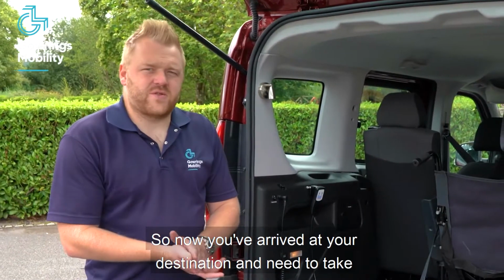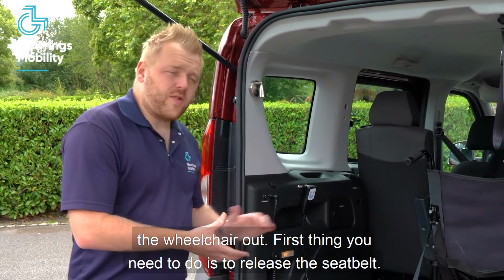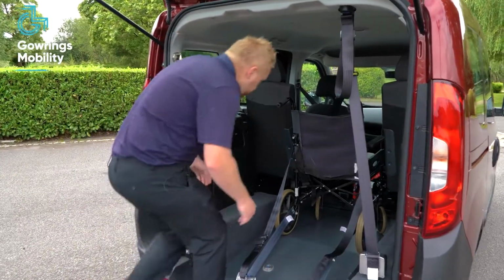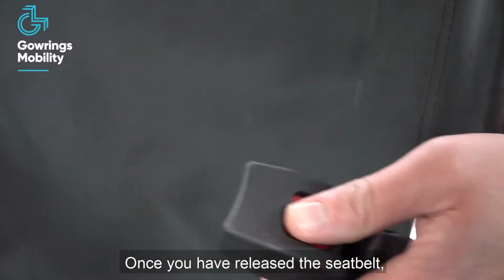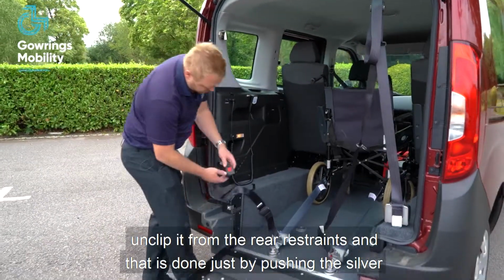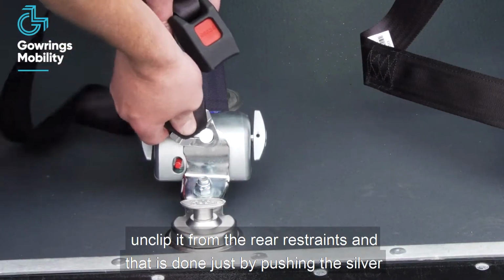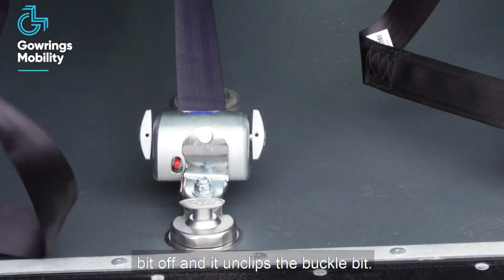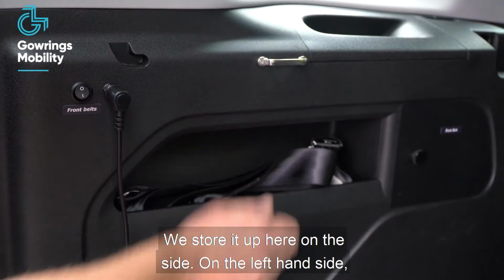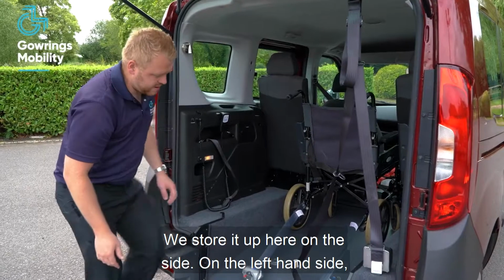So now you've arrived at your destination. To take the wheelchair out, first thing you need to do is to release the seatbelt. Once you release the seatbelt, you now need to unclip it from the rear restraints, and that is done just by pushing the silver bit off and it unclips. The buckle bit can be stored up here on the side, on the left hand side.